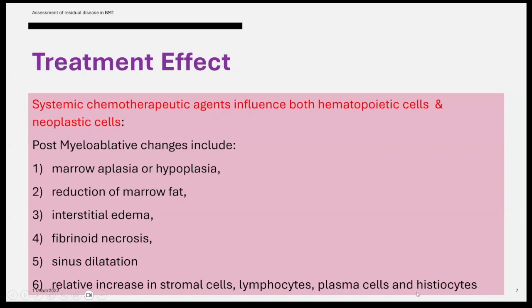The classical histiocyte will be very foamy, so it's easy. Even without immuno, you can tell there are foamy macrophages. But they are not alone. Normally they come together with interstitial edema, fibrinoid necrosis, or proteinaceous material filling the edema, and also sinus dilatation, which you can confirm by CD34.